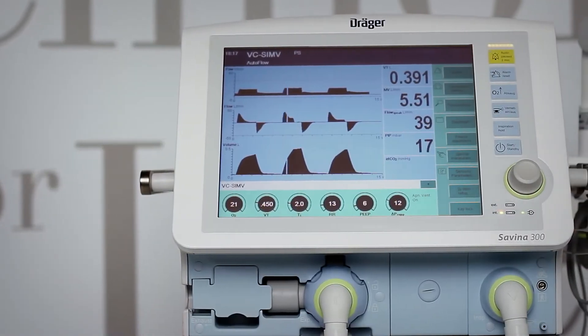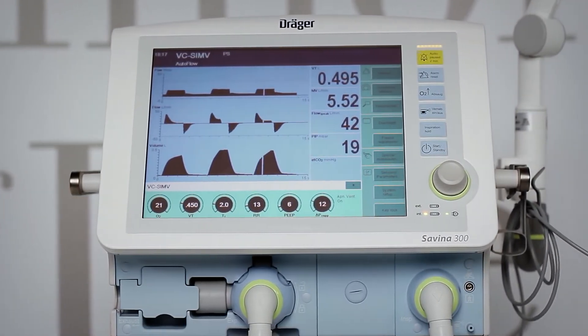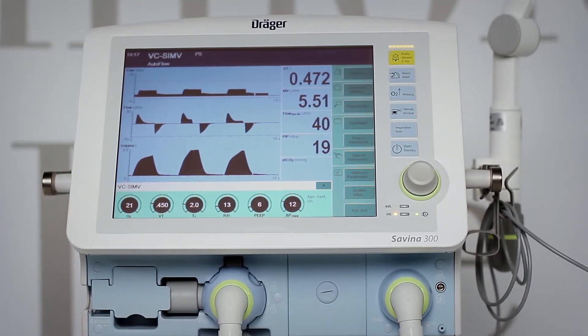Savina 300 can be used for the ventilation of intubated patients in the application mode tube, and for non-invasive ventilation in the application mode NIV.